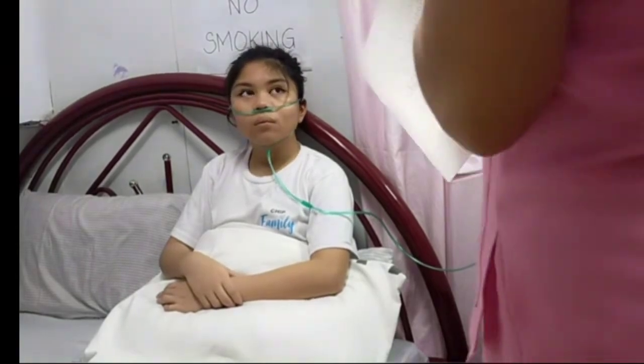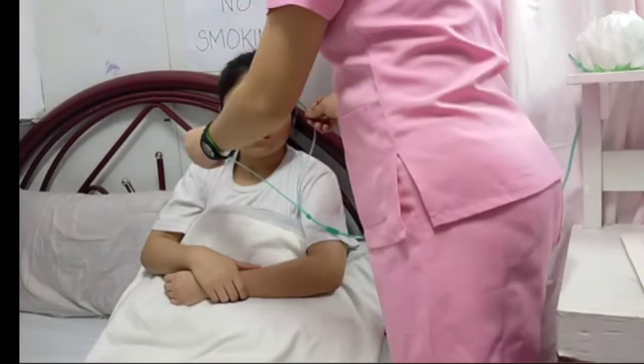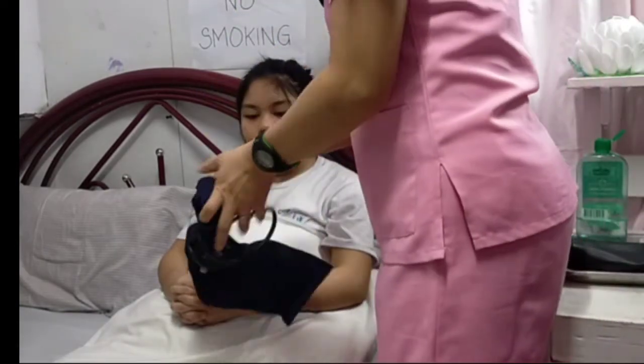Write down the time started. Watch out for symptoms of oxygen toxicity, including coughing, chest pain, or blurred vision. Aseptically remove the nasal cannula from the patient and discard according to hospital policy. Always check the patient's vital signs after the procedure.